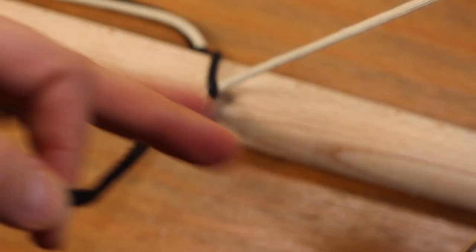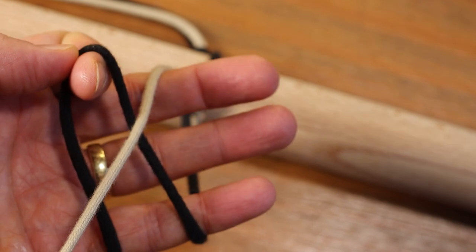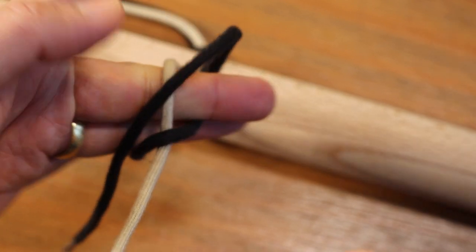Right, now we're on to the second tie. This time we're going the other way around — hold that black tie with a pincer grip using a karate chop action, cross over the white tie again, with the middle finger curl it round that hole, straighten it back up, hold it with those two fingers and then pull it through.